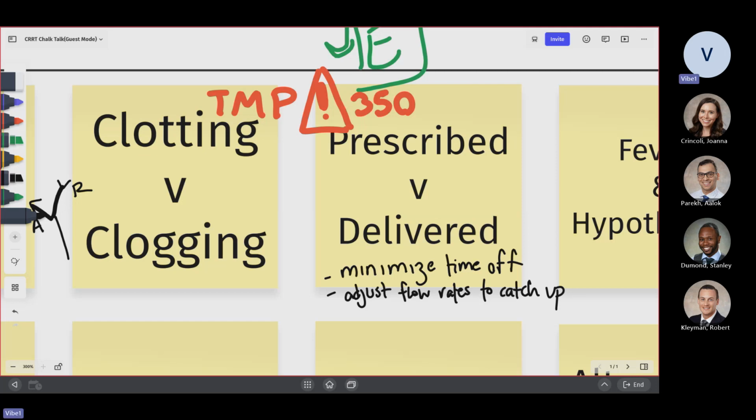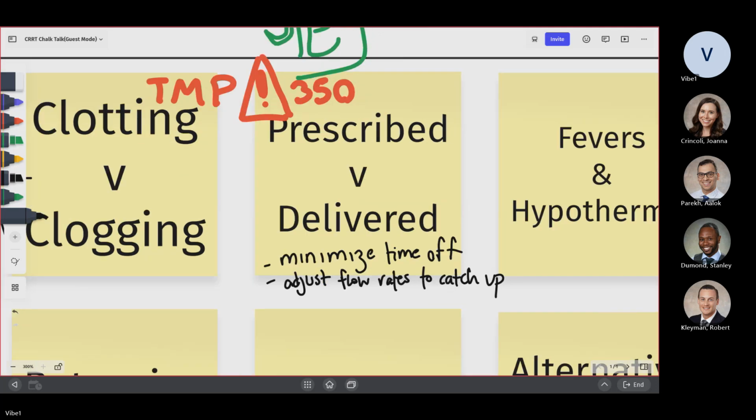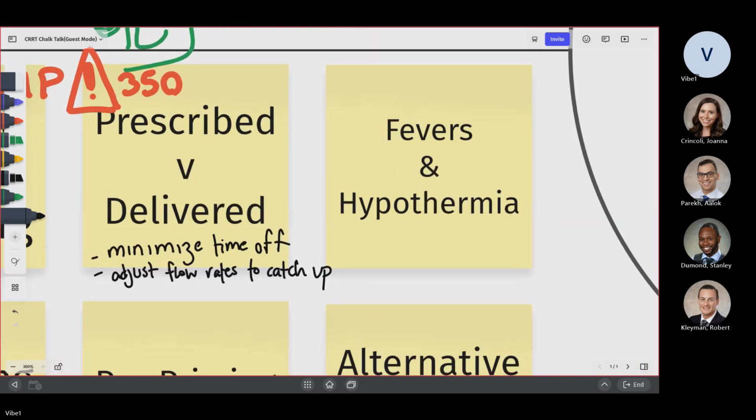So the other thing is, access wise, you technically have to use a permacath. Can you use an AV fistula or a graft? You can use an AV fistula or graft. The problem is it's not encouraged. A couple of things with it: the needles stay for 24 hours, so it has to be monitored. Somebody has to be sitting there continuously, because if it gets dislodged, the patient is going to bleed.